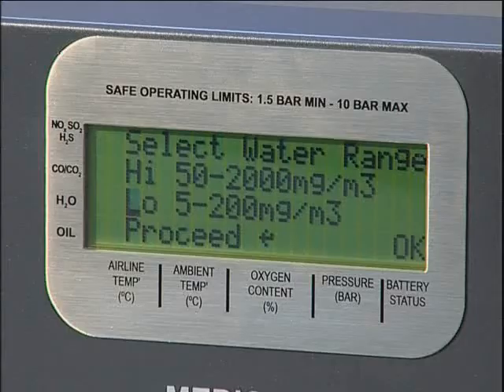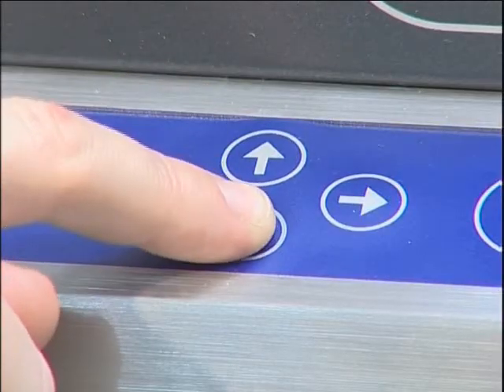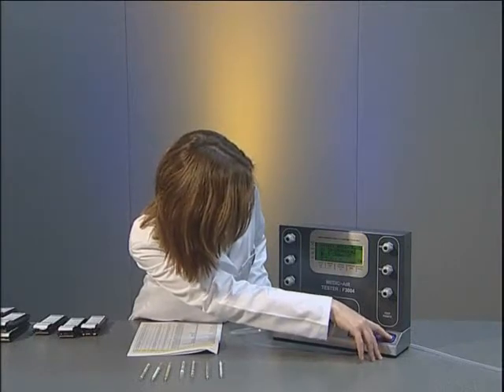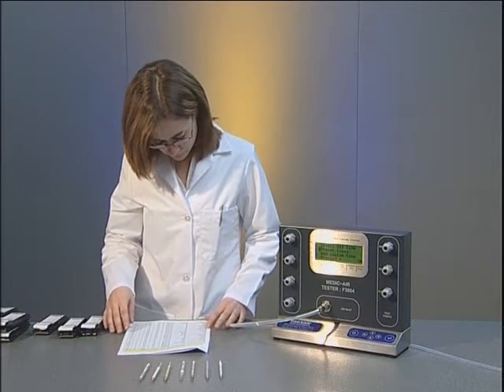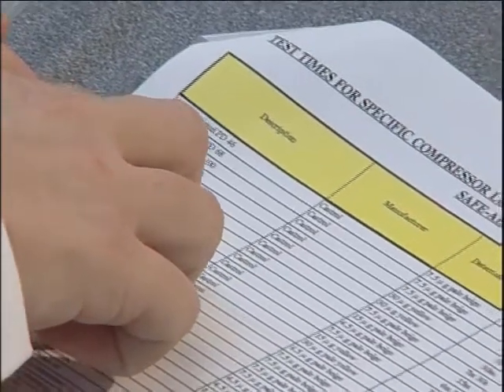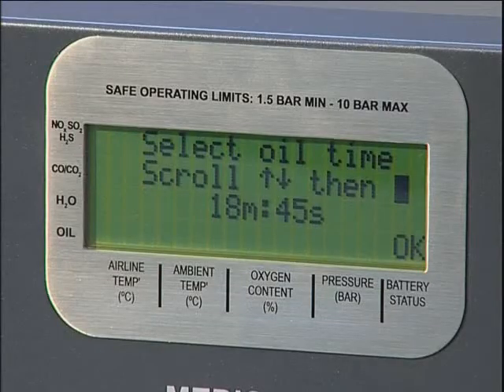The oil time must now be selected by entering the preset times menu and using the up and down scroll buttons. The oil time is selected to correspond to the particular type of compressor oil that could be present in the system being tested. This information can be found in the documentation wallet and is updated regularly on our website. The tester is programmed with four preset times, which cover the vast majority of compressor oils currently available. In this example, the oil in the system is known to be Castrol Air Coal PD100, with no risk of cross-contamination from other oils. Consequently, the 18-minute, 45-second preset time has been selected.